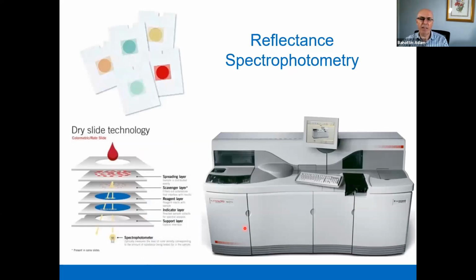This is a kind of instrument based on the reflectance spectrophotometer. These are test slides, dry, which we call dry slide technology.